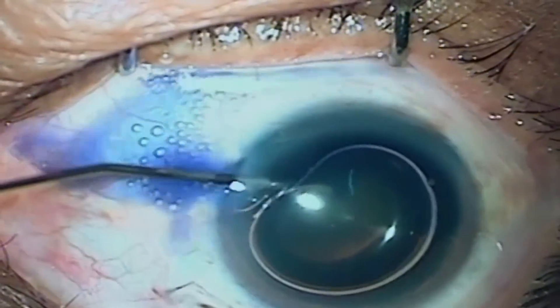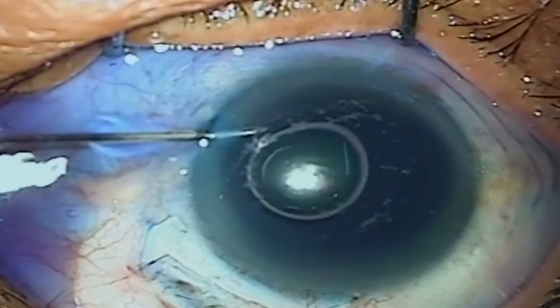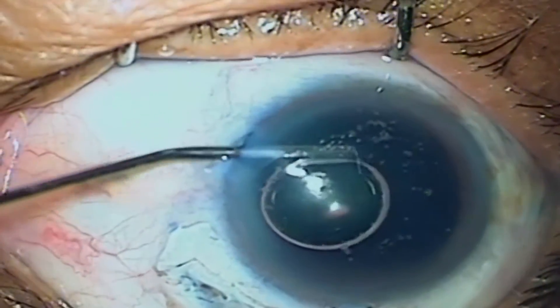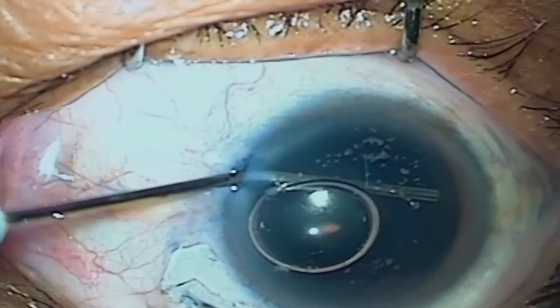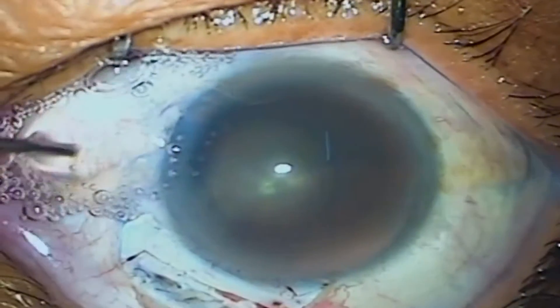Number two: cauterize the major blood vessels. Continuous use disturbs the surgical field and the eye is more red the next day. Do not try to cauterize the sclera — just target the vessels.